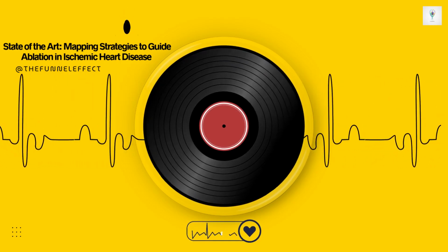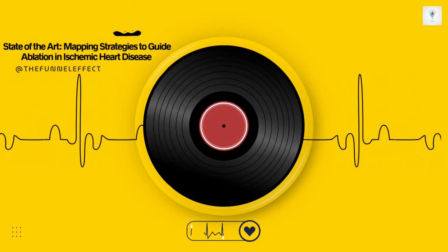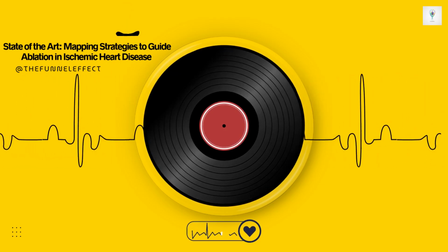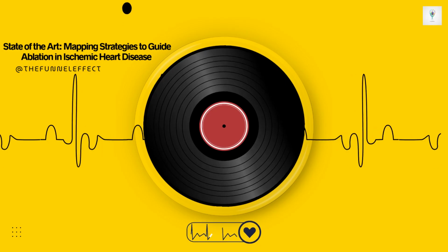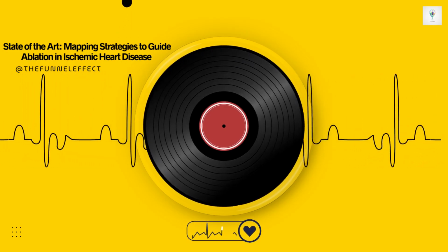ECF means two conditions are met simultaneously during that overdrive pacing. First, the QRS morphology on the surface ECG looks identical to the QRS morphology during the native VT. This is the concealed fusion. It means your pacing is entering the circuit and exiting through the normal pathway, activating the rest of the ventricle in the exact same sequence as the VT does naturally. There's no distortion of the QRS shape.